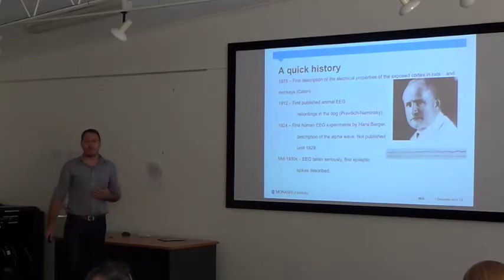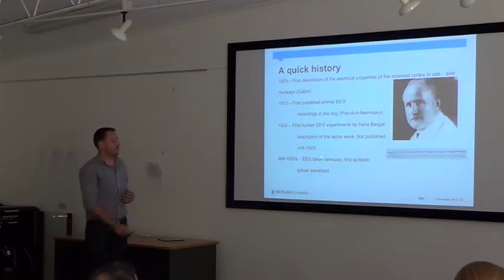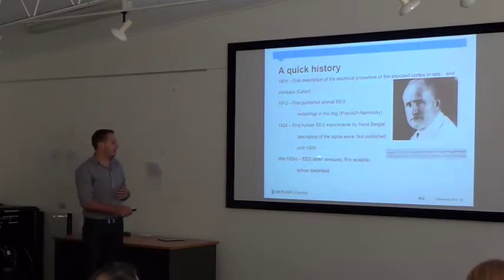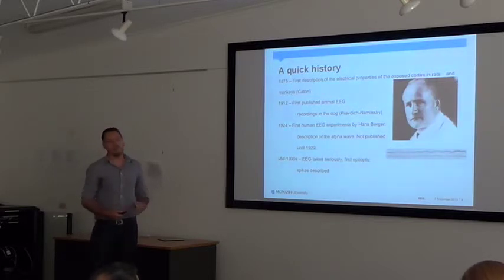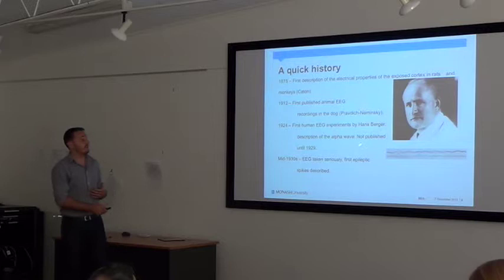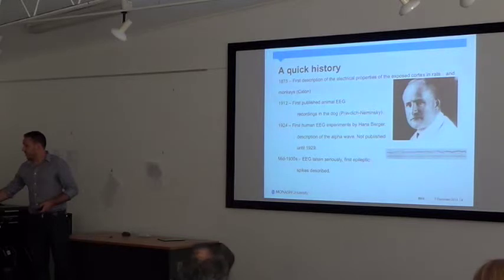And it wasn't until the mid-1930s that the rest of the scientific community took him seriously. He was considered quite a quack for quite a long time. So it wasn't until some fairly well-known scientists picked up this idea and first saw some epileptic spikes that this started to take off. And from then on, epilepsy was the main thing that EEG was used for. It was very much in the realm of the neurologists. But interestingly, in the mid-1930s, we also saw some description of the EEG waves from some psychiatric populations. So the idea of using this has been around for quite a long time.